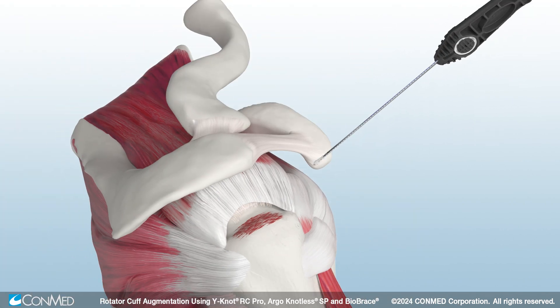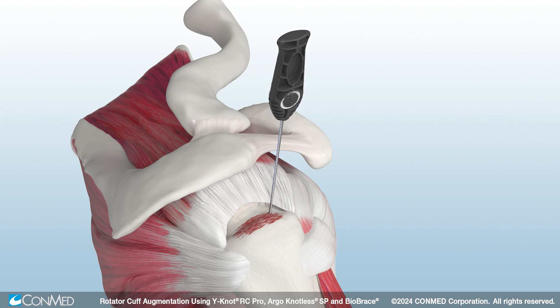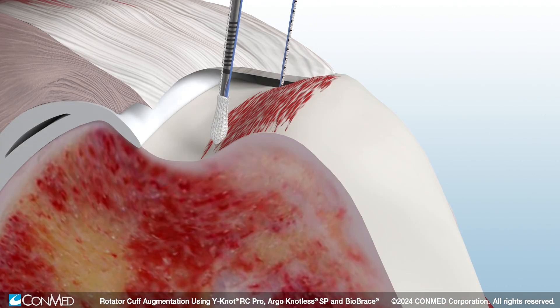Then insert the self-punching Y-Not Pro RC past the primary laser line. Pull back on the cleatless Pro handle to remove the driver and tension the sutures to set the anchor firmly beneath the cortex. Next, insert a second anchor. The Y-Not RC anchor contracts vertically and expands laterally to provide 360-degree form fit fixation.